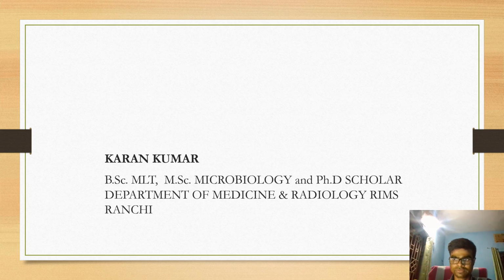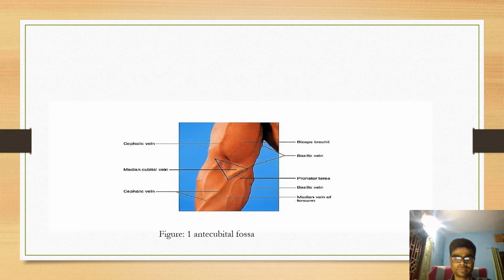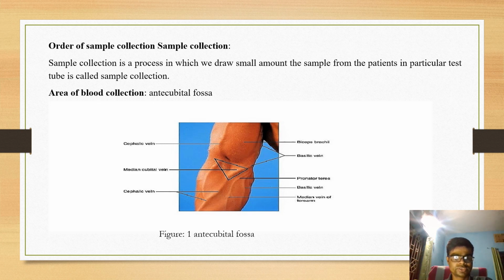So, move to the next slide. First I would like to tell you the order of sample collections. Sample collection is a process in which we draw the sample from the patients for a particular test; it is called sample collection.